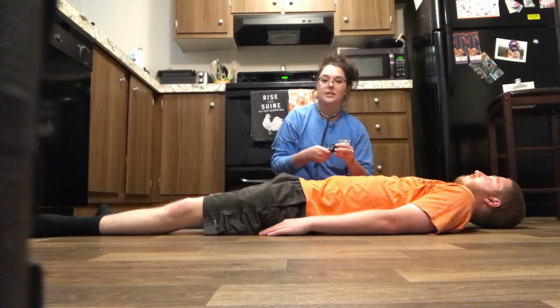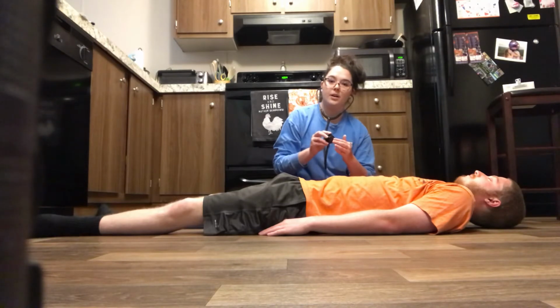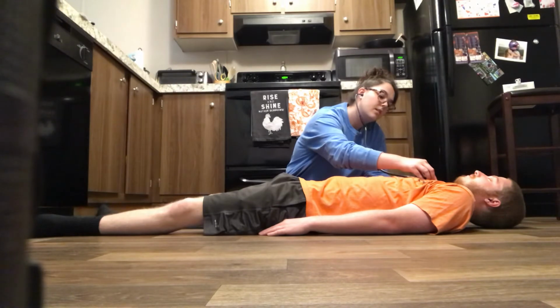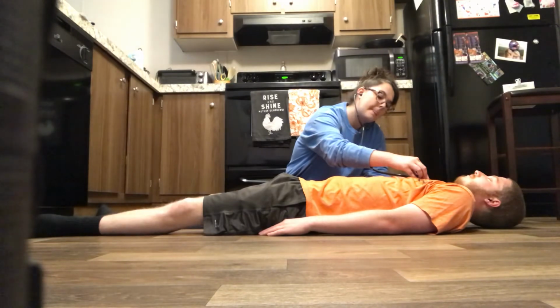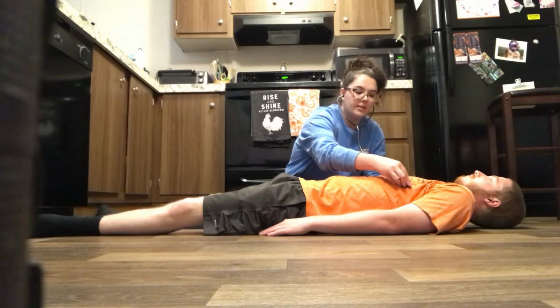And then you're going to listen to the same places, but you're going to turn your stethoscope to the bell part. So second on the right, second on the left, third on the left, fifth on the left, and then fifth at the midclavicular line.